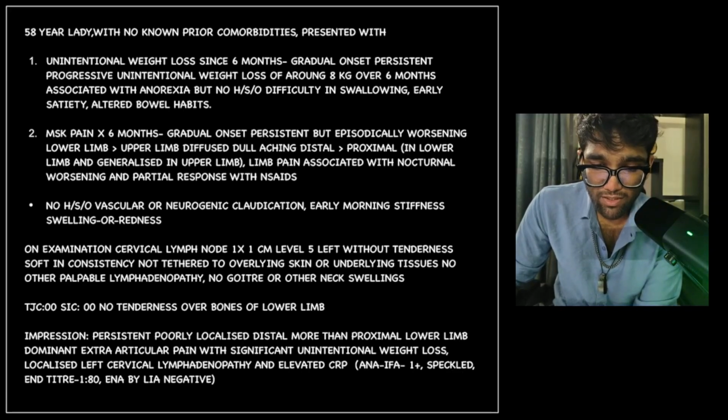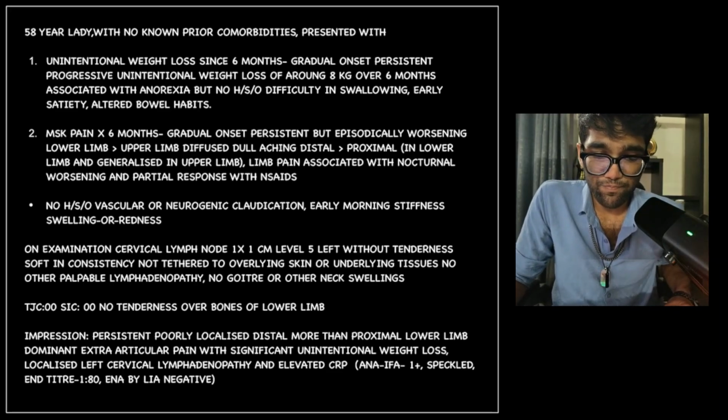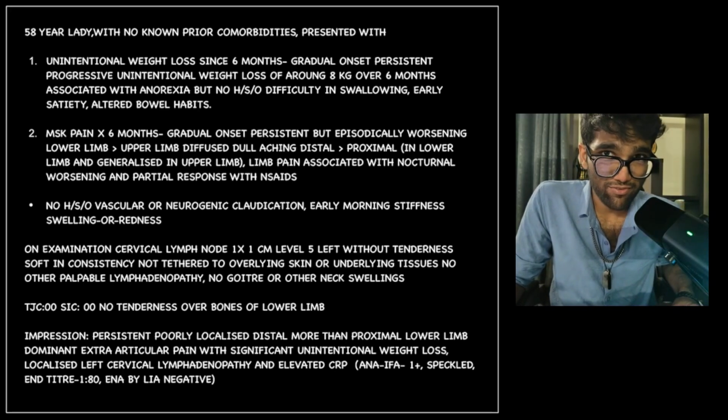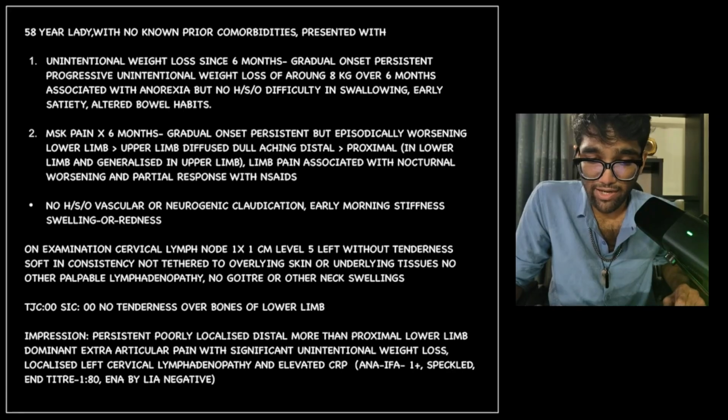So this is where we were at. And in such a case, the lymph node can only tell you something if you know what you're looking for. In the course of this discussion, I'm going to try to elucidate that and make it clear how that helps you fine tune the diagnostic framework that we had arrived upon previously.